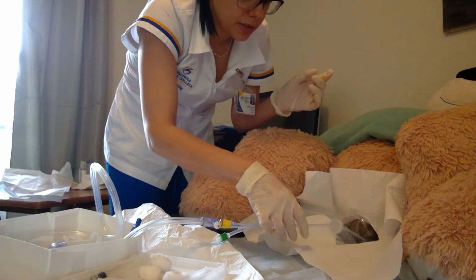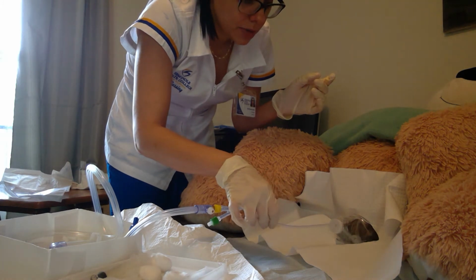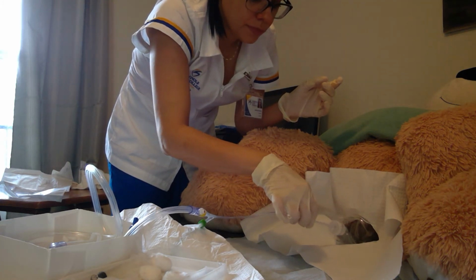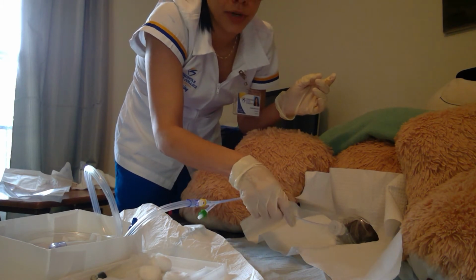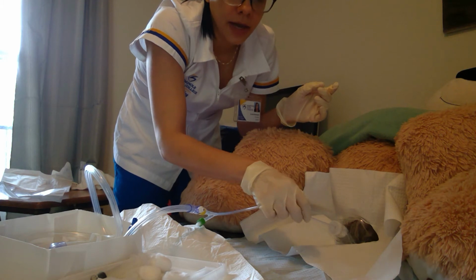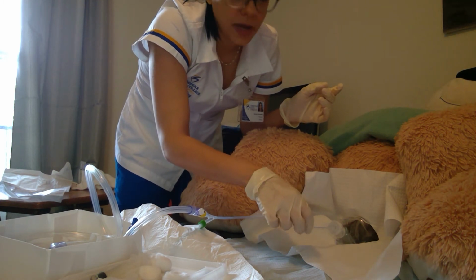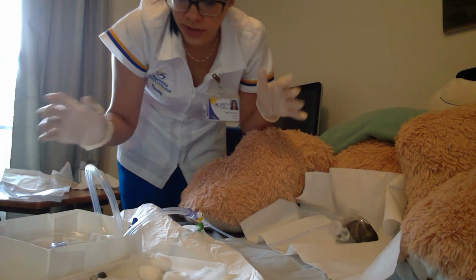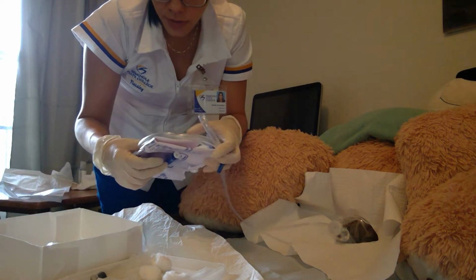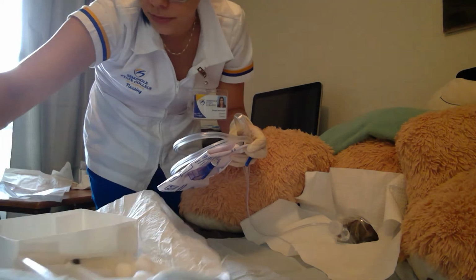And I can gently pull this down until I can no longer do it, which basically means that my balloon was filled up and that my catheter is in place, inside of her bladder. So now I can take all of this stuff away.